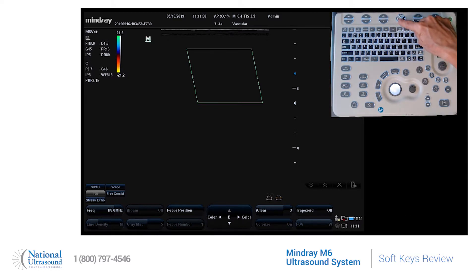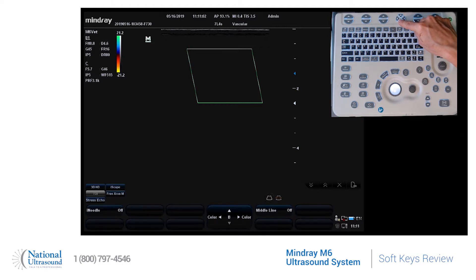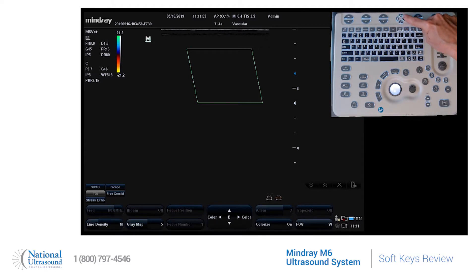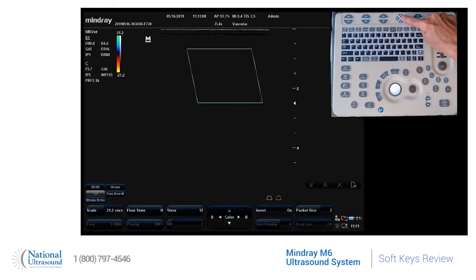I press up or down to scroll through the different options, and I can press the right or left to get back to B mode or color mode. Right or left will change the mode, and up and down will scroll through the options for each mode.